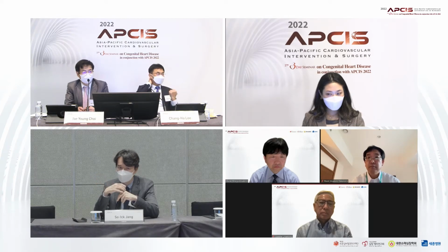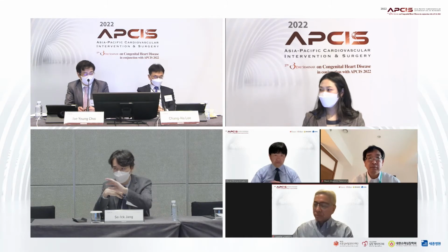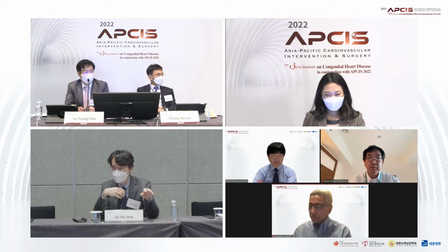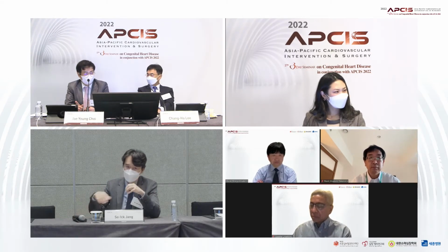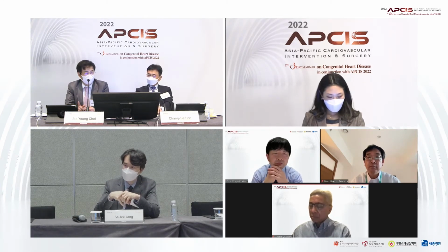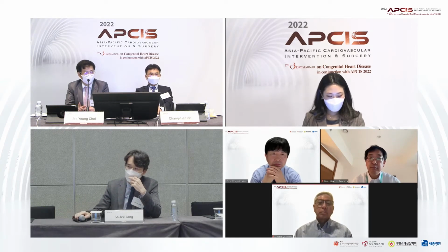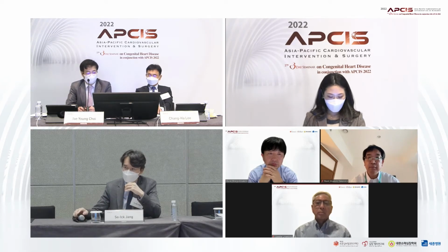So we want an MPA to RPA or MPA to LPA stent, and then leave only the side branch open, the LPA. And if it doesn't work, you can put another stent, just like a Y stent technique. Yeah. Okay, the smart decision, I think.